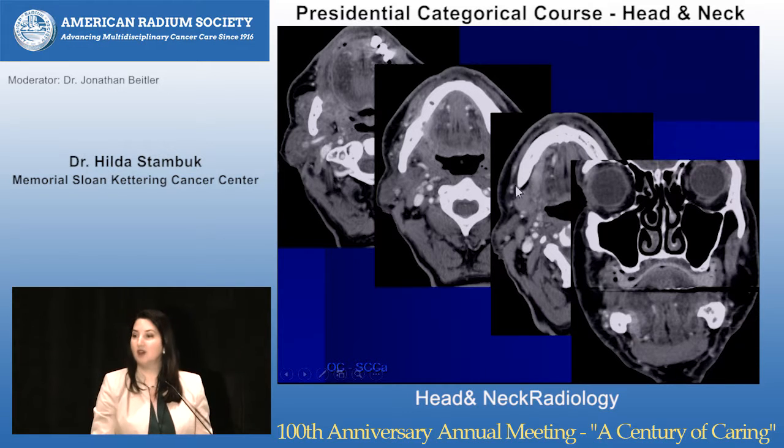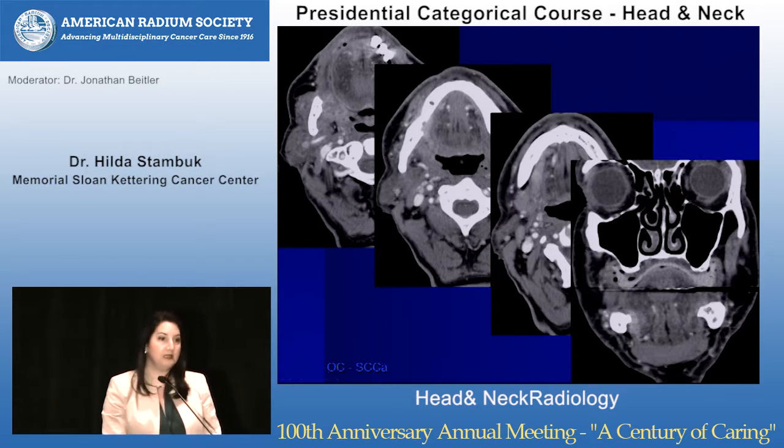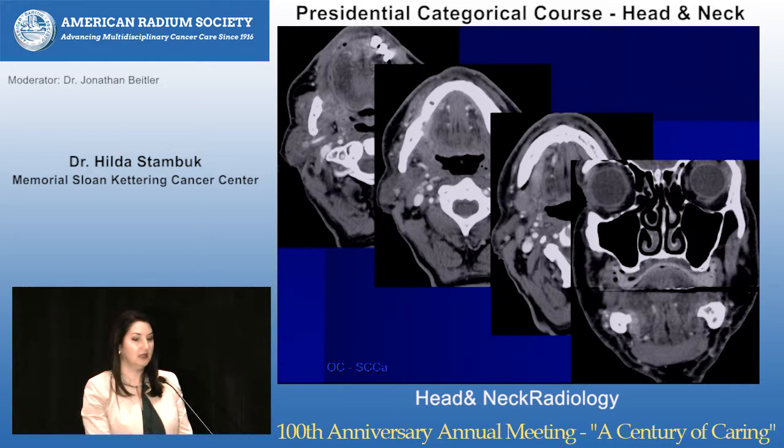The important point here is this is all submucosal spread. It won't be seen on clinical examination. You need to recognize it on imaging.